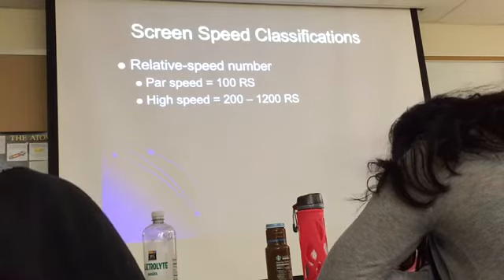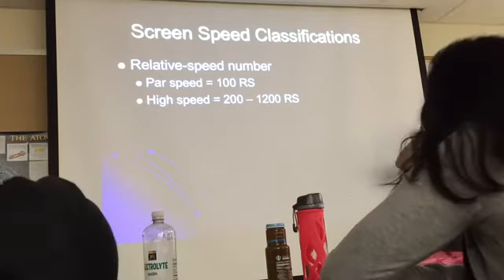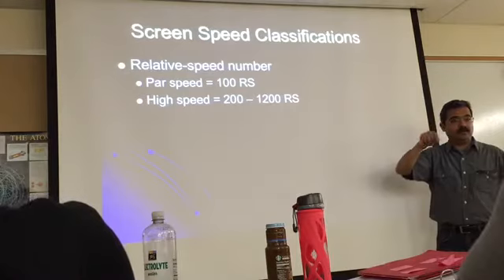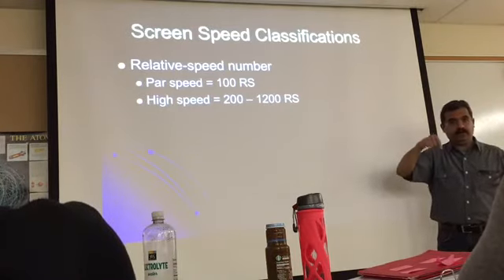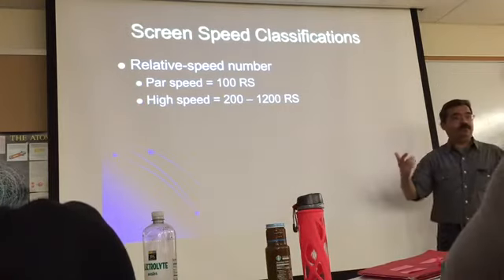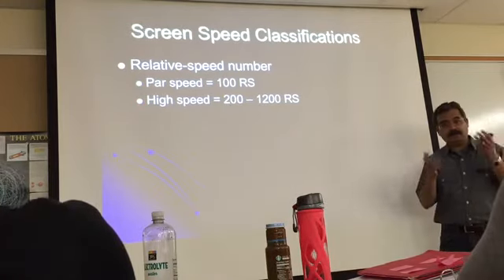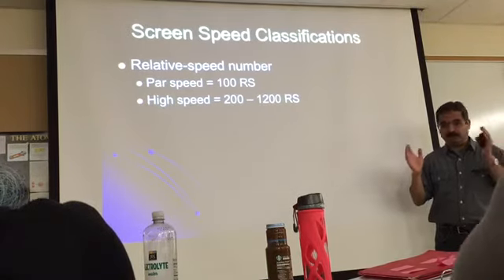has contrast media flowing. If you see contrast media flowing, that means that blood is flowing. If you see that the contrast media is stopping, you know that something is going on there. Maybe a blood clot, maybe a malformation. Or if you see contrast media leaking off the vessel, you know that the patient has a cut vessel and has a hemorrhage, right? And so that's what you're looking at.